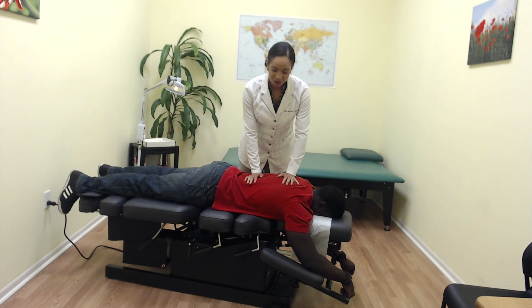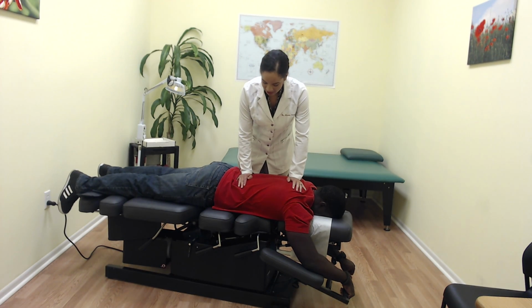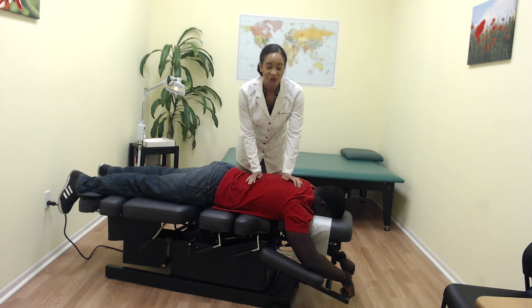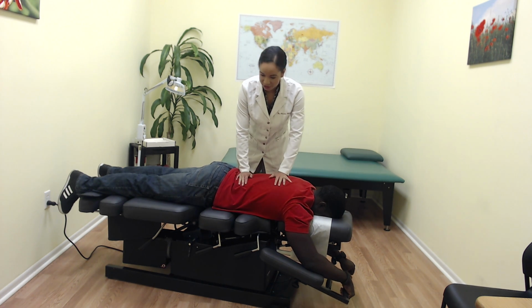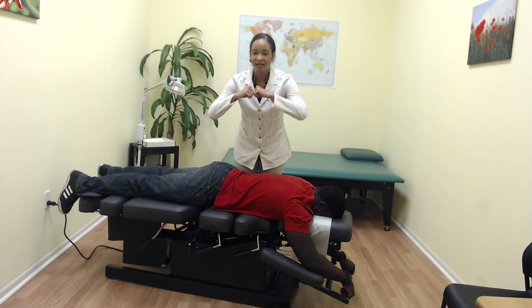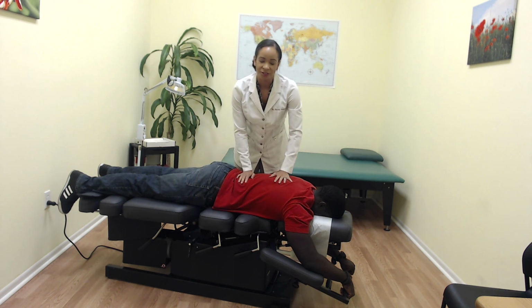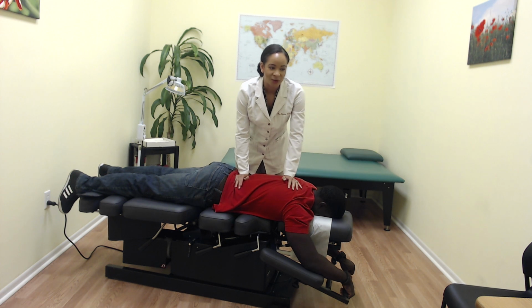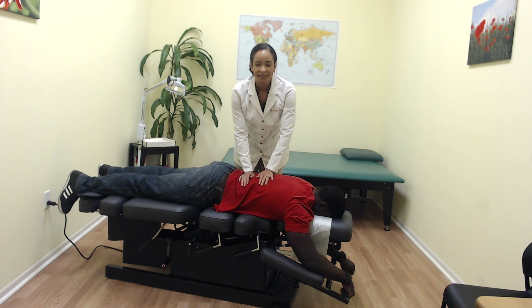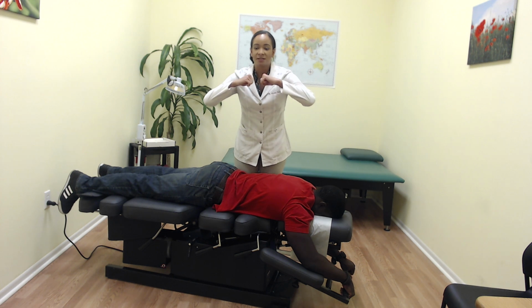Today we have a patient who's got some low back pain. So what we're going to do is demonstrate the use of our automated Flexion-Distraction table. Flexion-Distraction, just like it sounds, flexes the low back and distracts, meaning it stretches it. It's really good for patients who have disc problems, chronic low back pain. What it does, again, is help to open up the disc spaces.